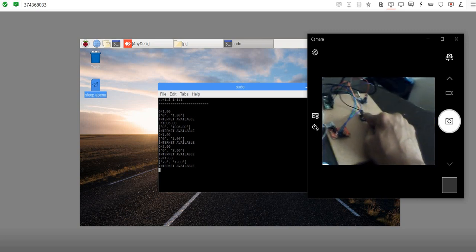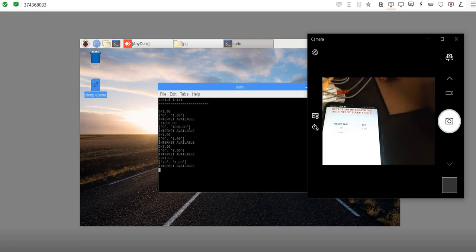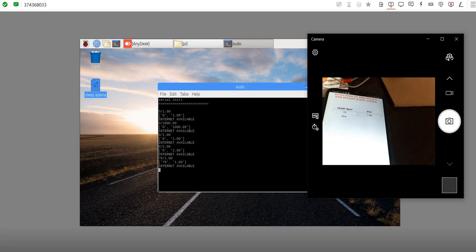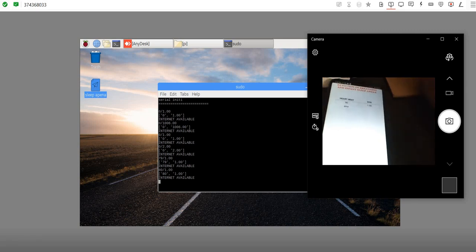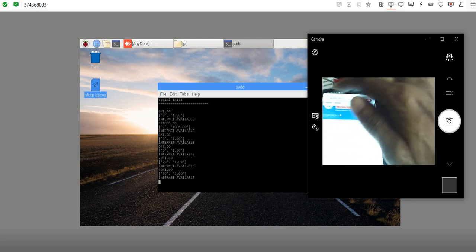And what we have done is, if the heartbeat is less than 70, then it will give you the alert. So now after a few seconds I am removing my finger from the heartbeat sensor. Let's see how much it is calculated right now. It will be calculating some value, and thereafter if the value calculated is less than 70, then it will give you the exact value. It has updated right now. Let us keep the hand now, and after the update immediately keep your hand.